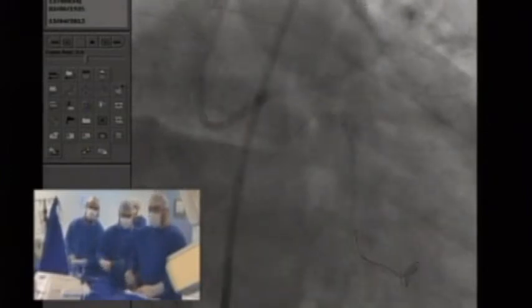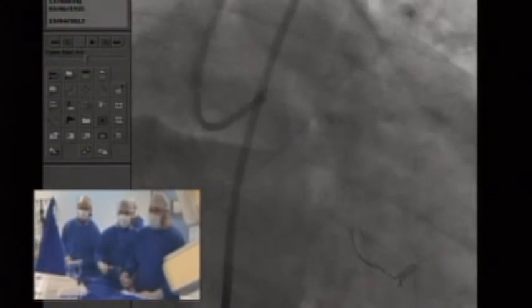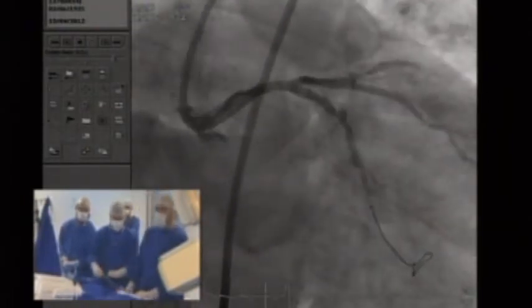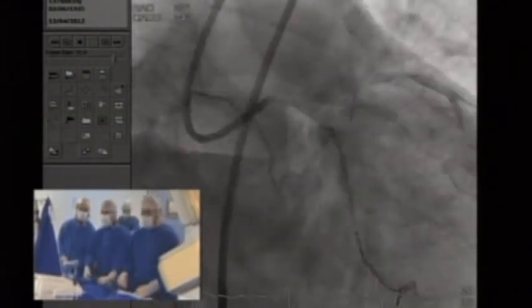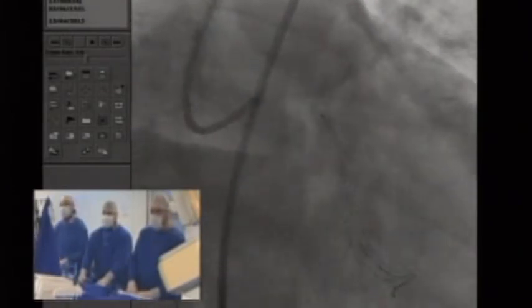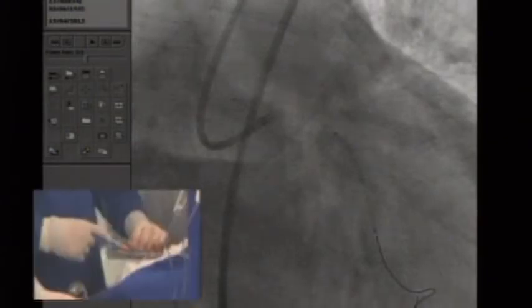Mauricio, in your service, here is a little bit of a different situation. Marco will perhaps deploy 5 or 6 drug-eluting stents. In your practice, despite the patient not being very happy with surgery, in a multivessel disease patient like that, would you insist? Hold on, Marco, we're just discussing here a little bit. We can't hear you.